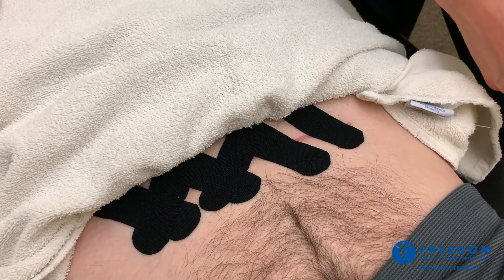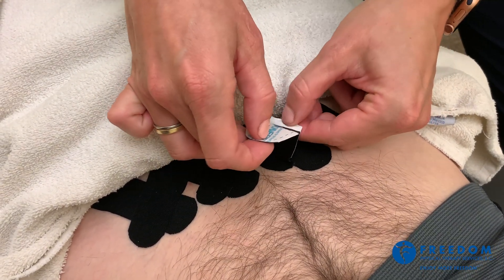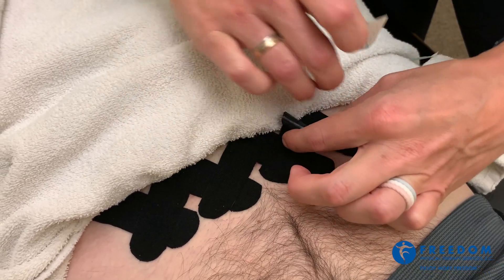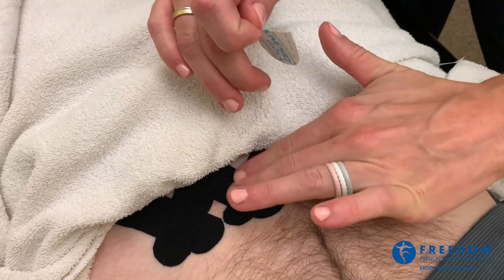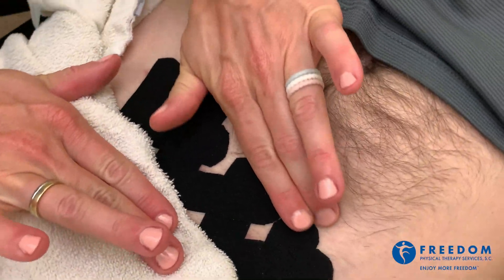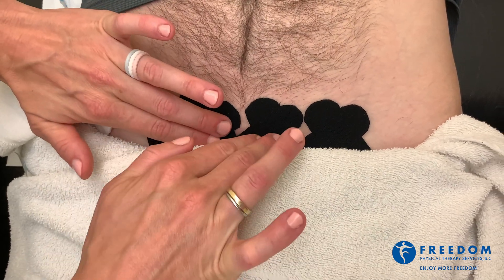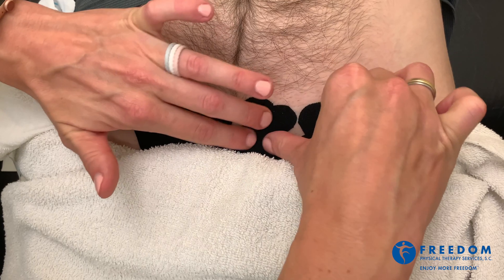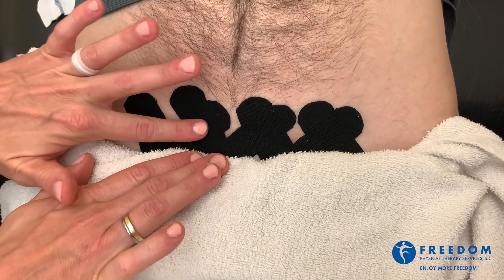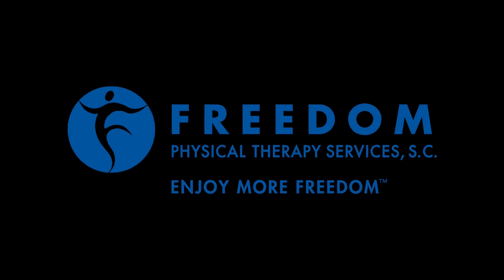We're just going to do one more piece for this end here. We want to make sure that the tape is adhered. You can see how it moves into different directions as he engages the abdominal musculature. That will be pulling and tugging at that scar all day long and through sleep as well. So it's a nice way to get that scar moving a little bit better.